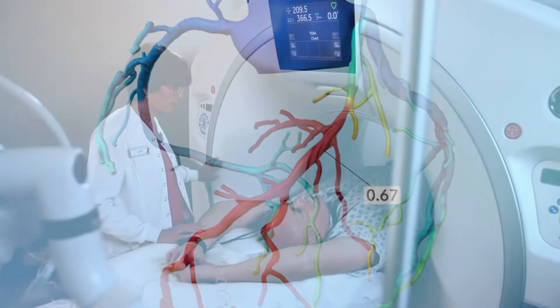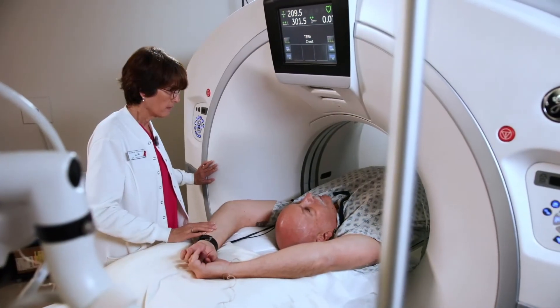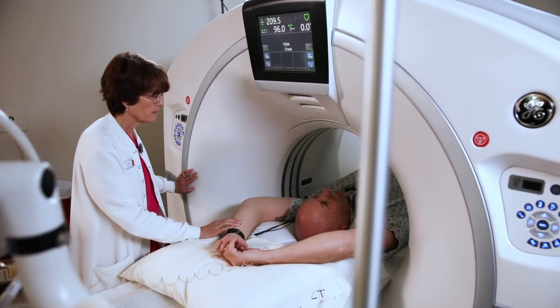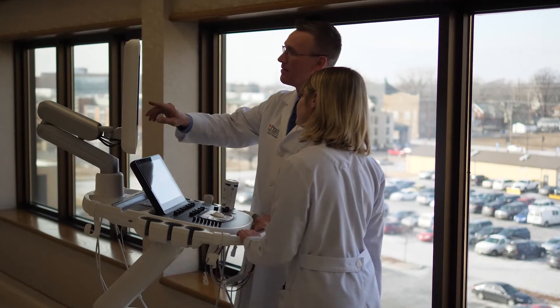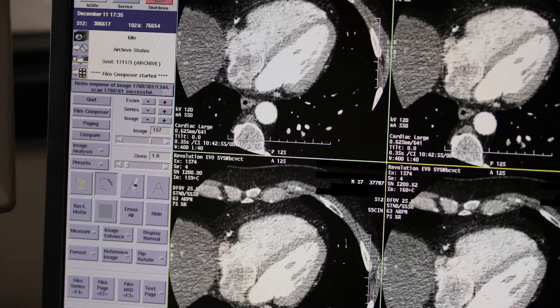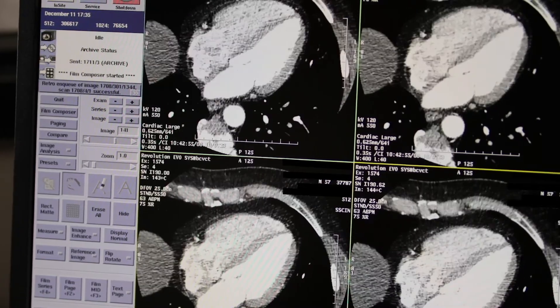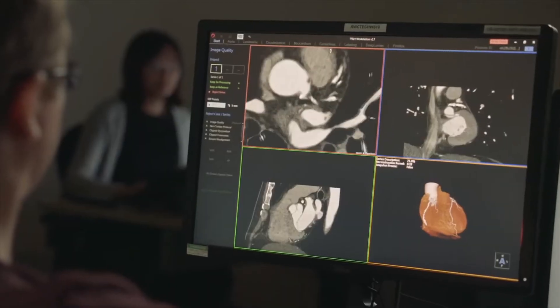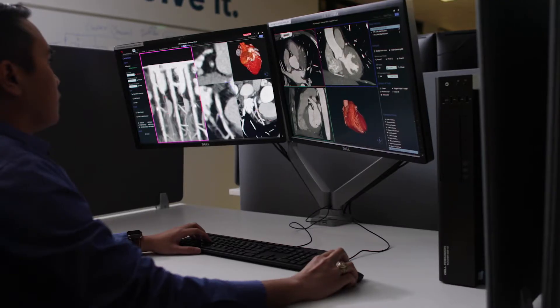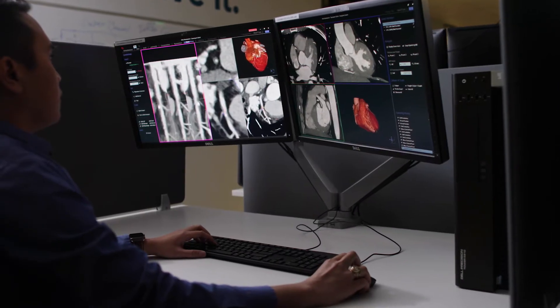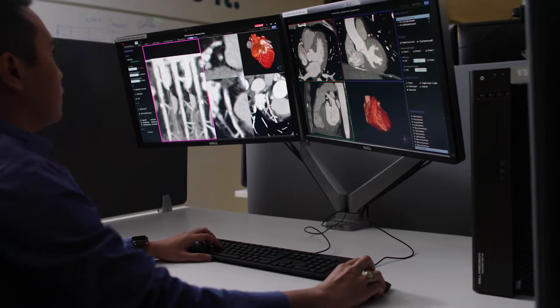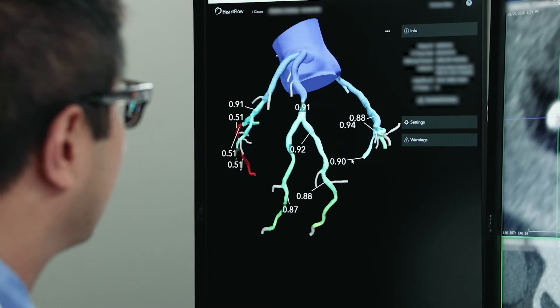The process begins with a standard non-invasive CT scan of the heart. If your physician determines that no disease is present, no further action is needed. If the CT scan shows disease, your physician can send the scan to HeartFlow, where a color-coded digital 3D model of your coronary arteries is created.